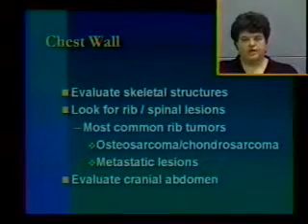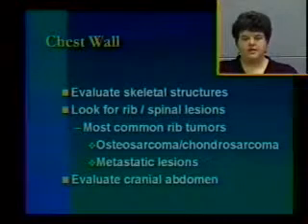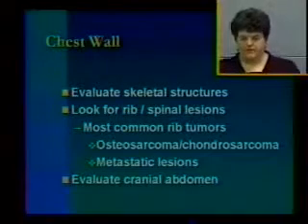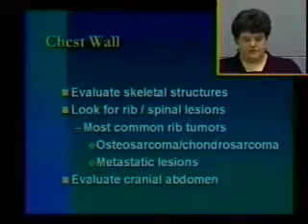And then finally, you don't want to forget to evaluate the cranial abdomen, because you may get a hint that there's some abdominal disease going on and that you need to further evaluate the abdomen with radiographs or ultrasounds.